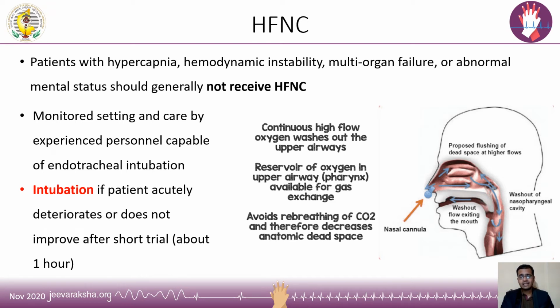Because it acts as a natural reservoir, when the patient is tachypneic and draws in air, this oxygen enriched air goes to the lung and it helps in treating his hypoxemia. Because the flow is high, it generates some form of PEEP. As you all know, PEEP helps in oxygenation. So this is the basic mechanism of how high flow nasal cannula acts. It avoids the rebreathing of CO2 and therefore decreases the anatomical dead space.